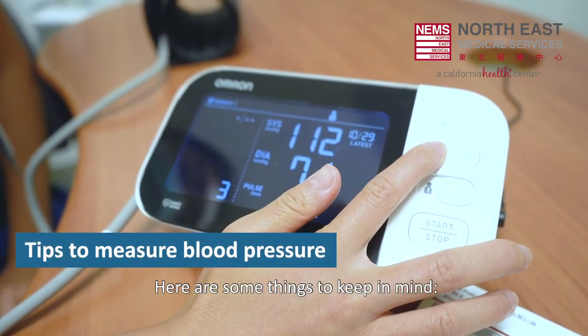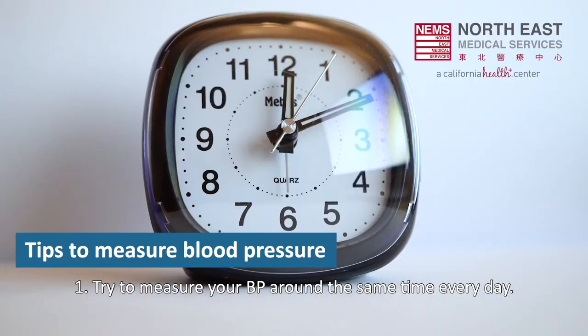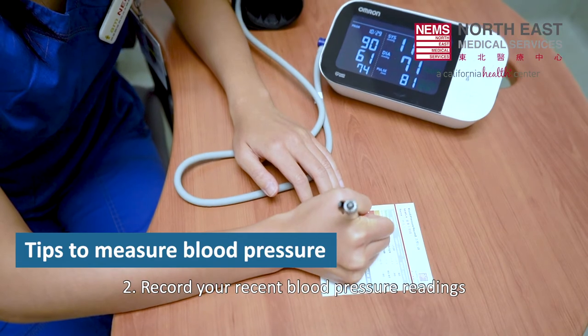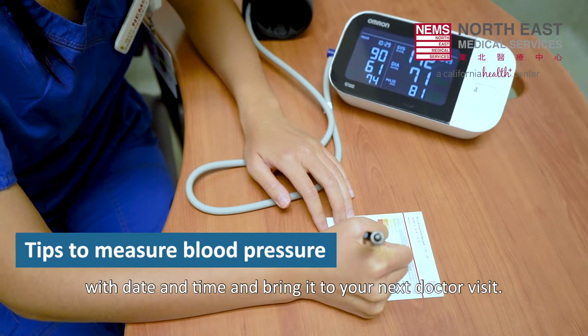Here are some things to keep in mind. One, try to measure your blood pressure around the same time every day. Your blood pressure fluctuates throughout the day, so it is best to be consistent with daily measures. Two, record your recent blood pressure readings with the date and time and bring it to your next doctor visit.